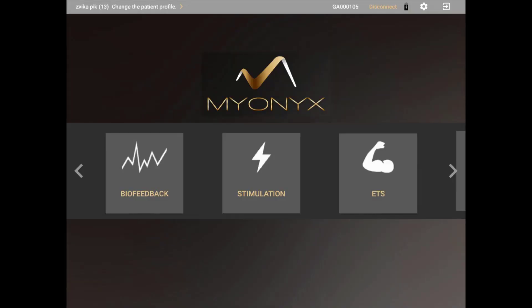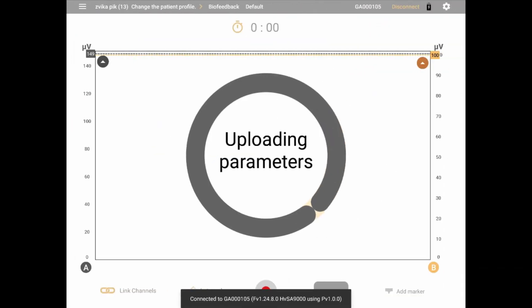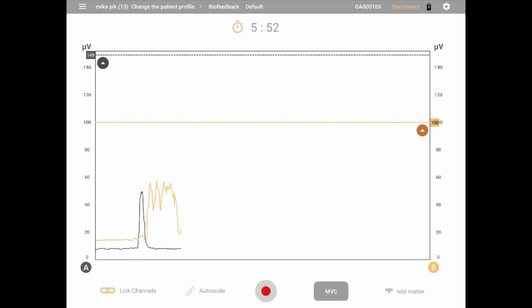Enter biofeedback mode by clicking the biofeedback button in the main menu. This will load the biofeedback preview screen. In this screen, you can view the quality of the signal, adjust the view settings, set the session parameters, and begin a session.